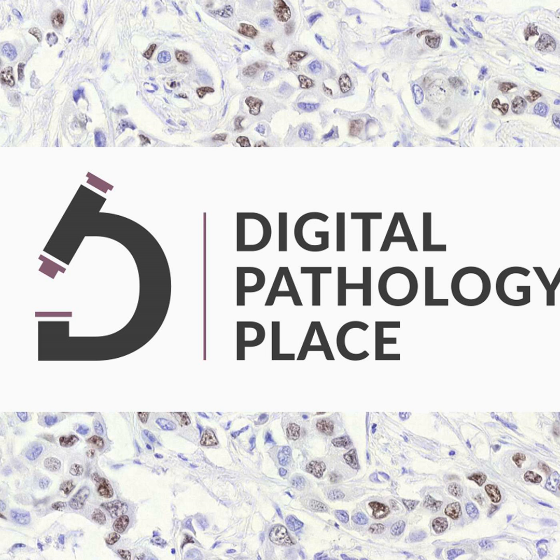You know that staining and generating H&E images takes several hours, 8 hours, I don't know. I remember in my residency we had to switch on all the machines for staining, and whenever somebody forgot and would come during the night because they remembered they forgot to switch it on, then the whole operation would be delayed for a few hours. We can skip that because we can image unstained sections.